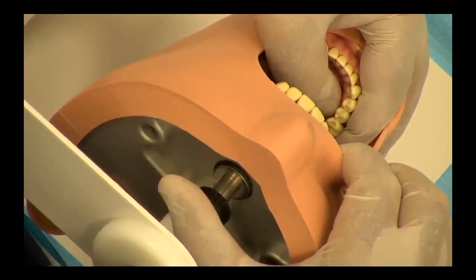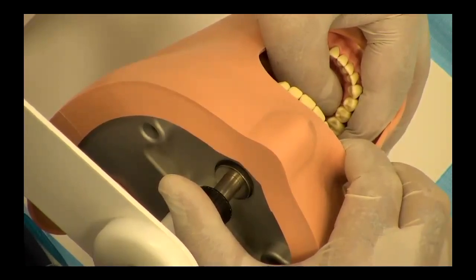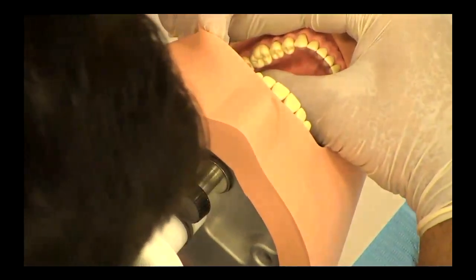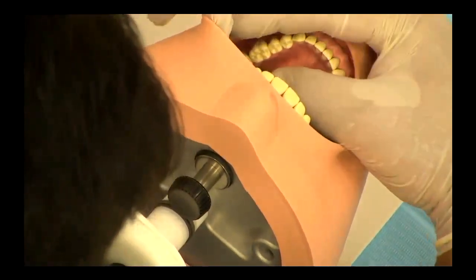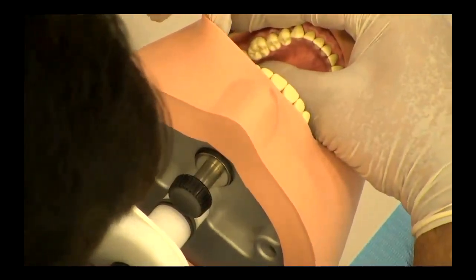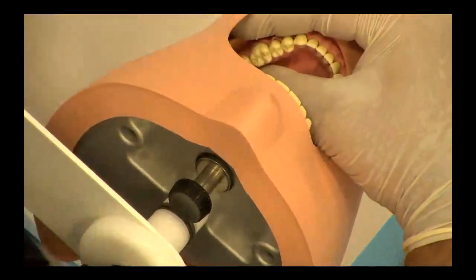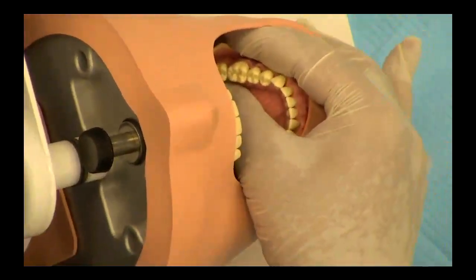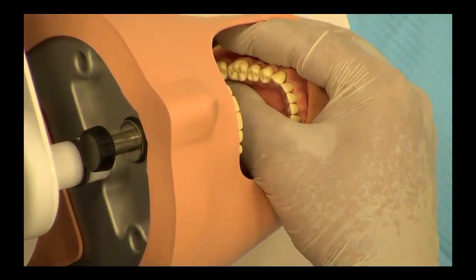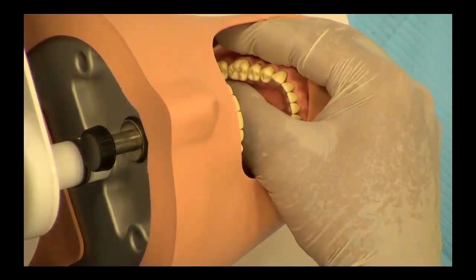And as I explained in the position of the operator and the patient, if you are a left-handed operator, for the mandibular left posterior quadrant, you will have the forefinger on the buccal, thumb on the lingual side, and the three fingers, here you can see the three fingers, supporting the mandible at the base. That's for the left-handed operator.